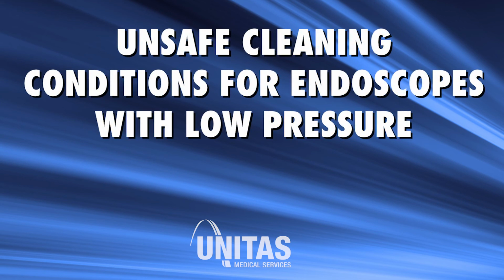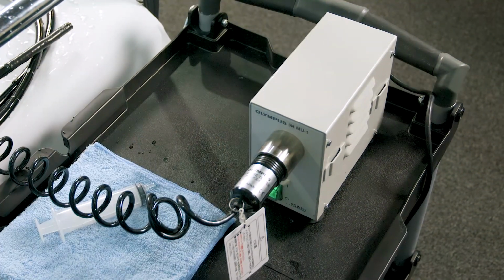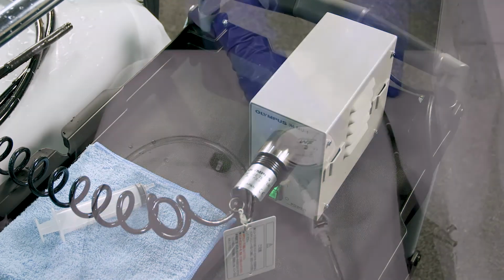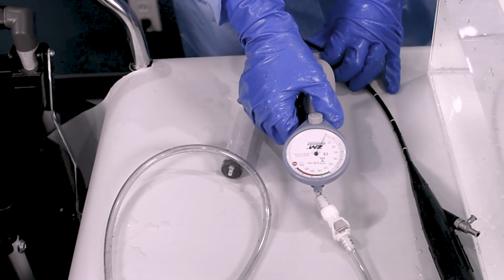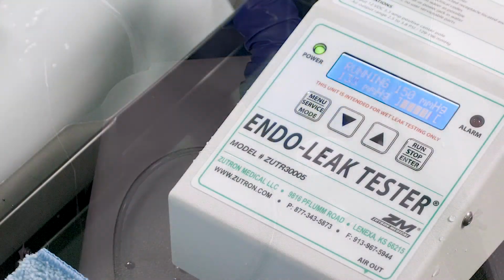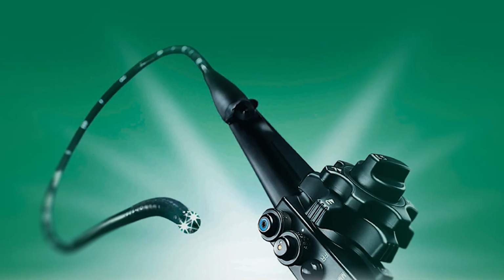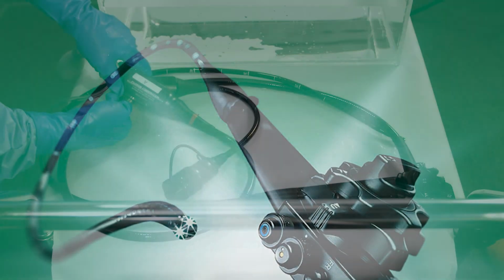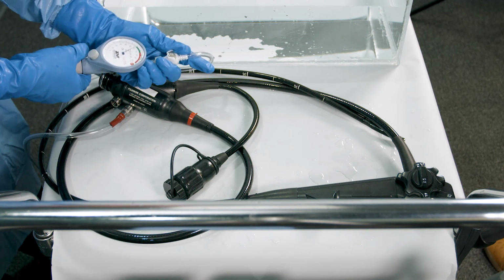Unsafe cleaning conditions for endoscopes with low pressure. Always confirm that the established required pressure is able to be maintained on the leaking endoscope during the decontamination process. This mostly occurs from a large cut, torn or disconnected channel, open control bodies, or if using a handheld leak tester versus electric. You may need to apply external tape or take extra care to protect a large area that's cut to reduce air loss and avoid serious additional fluid damage.